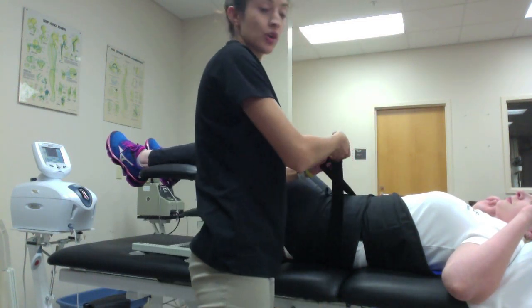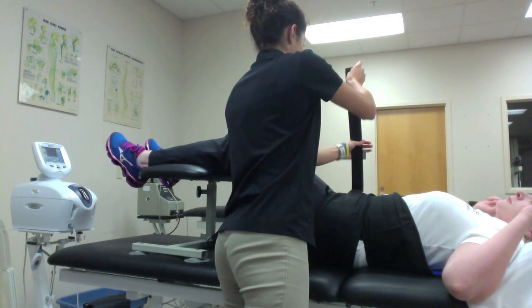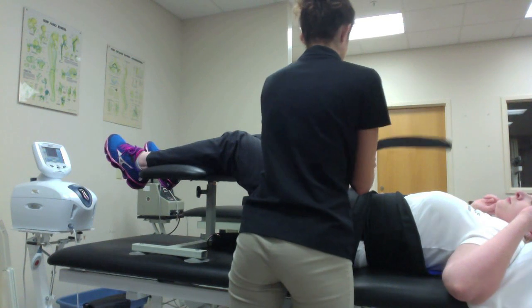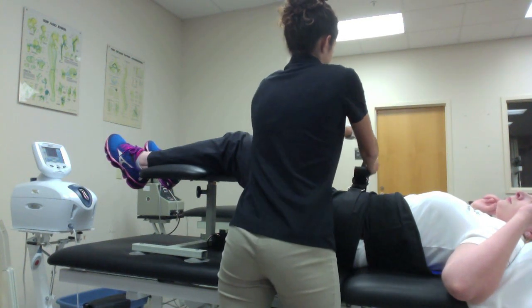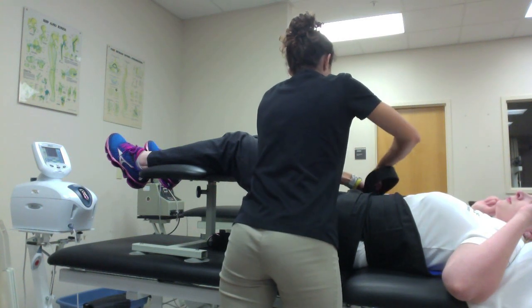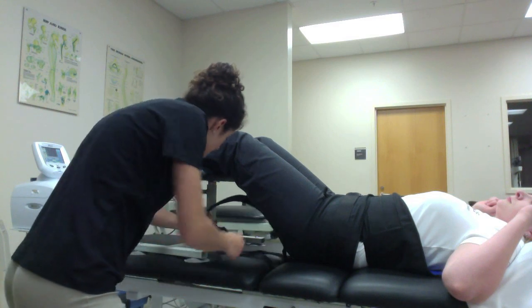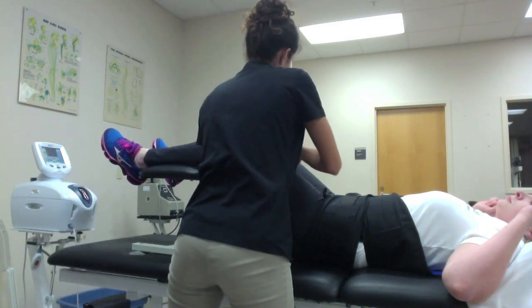I want to make sure that this O-ring right here is going to be right in the center because that's where the J-hook will insert. So I can see that that's right in the center. Just to make sure that this is nice and snug. How does that feel so far? Good. Alright. Now that's on there, I can insert the J-hook right into that O-ring.